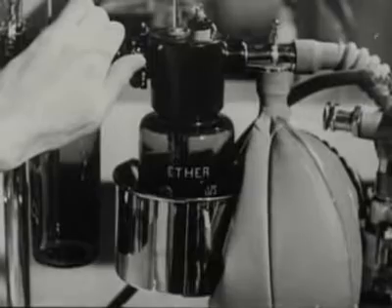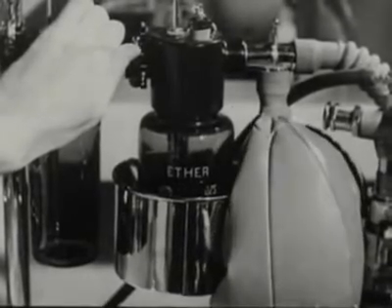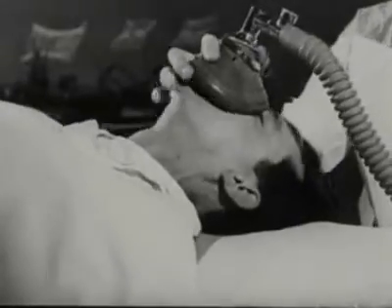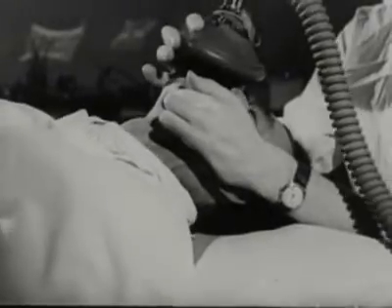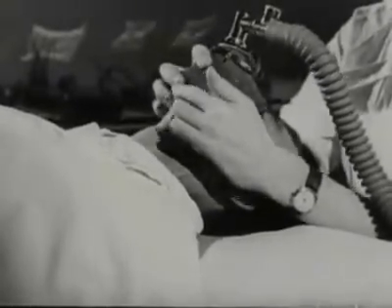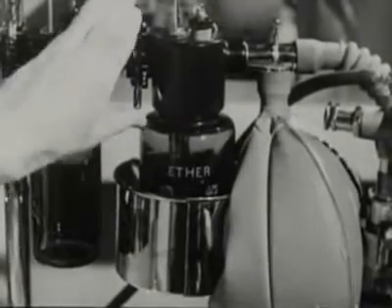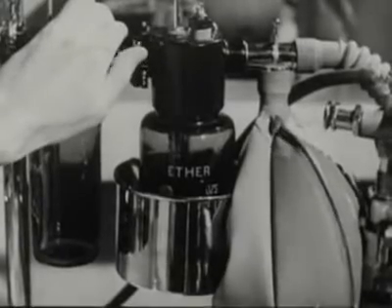If you increase the concentration of ether vapor too fast and the patient coughs, turn it off again and remove the mask. You'll waste less time this way than if you persist with the ether and the patient develops laryngeal spasm. Start again with the tap a little short of the setting that produced the coughing, and move it up gradually.